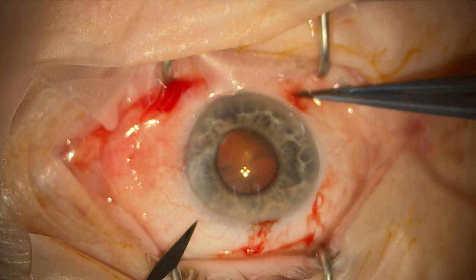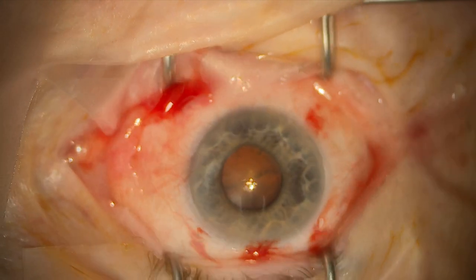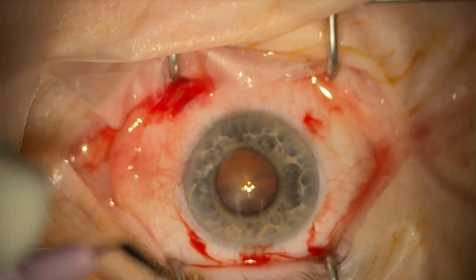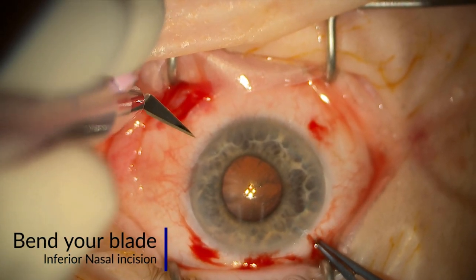You can use a needle or different types of blades such as an NVR blade. I'm using a 15 degree in this video, and another tip is that you can bend the blade just to help you get access to that inferior nasal portion, as you can see here.